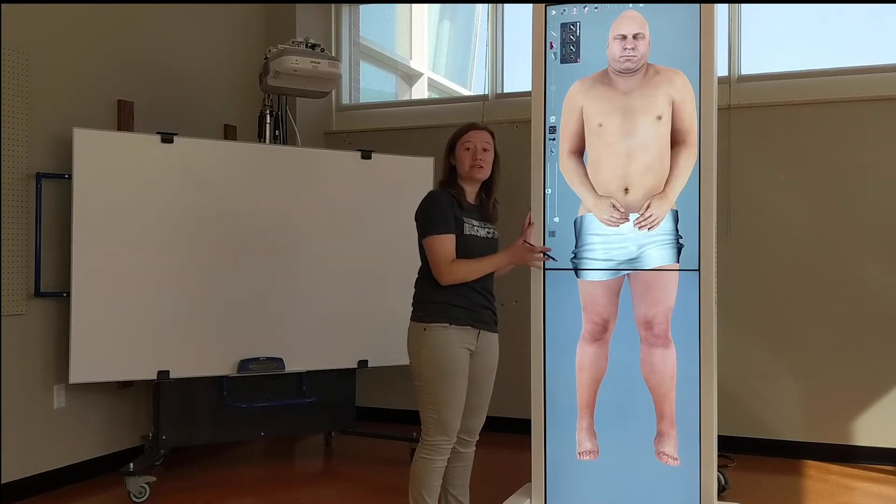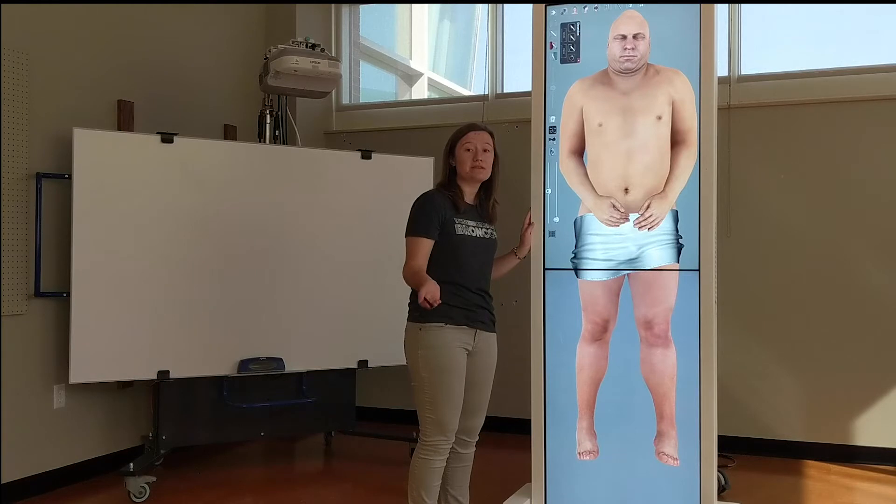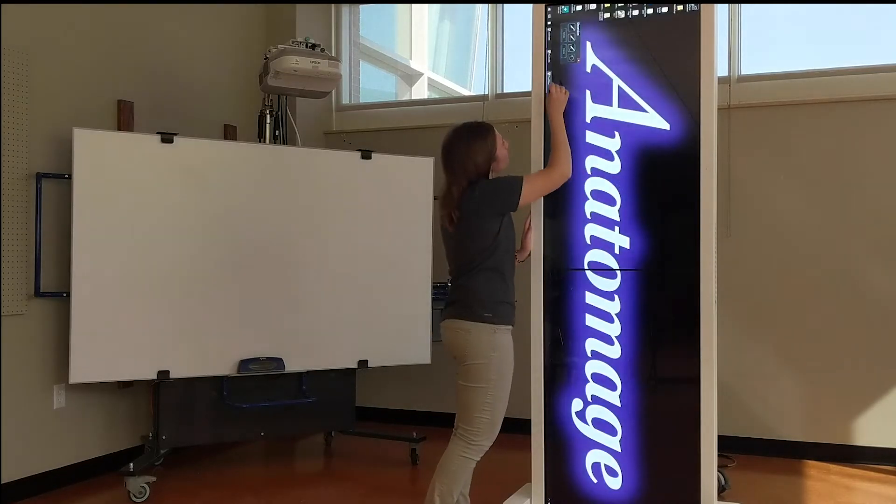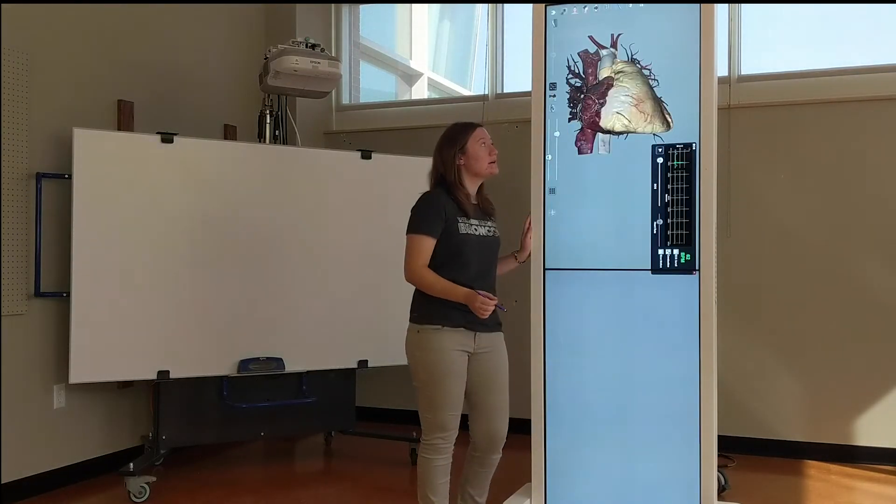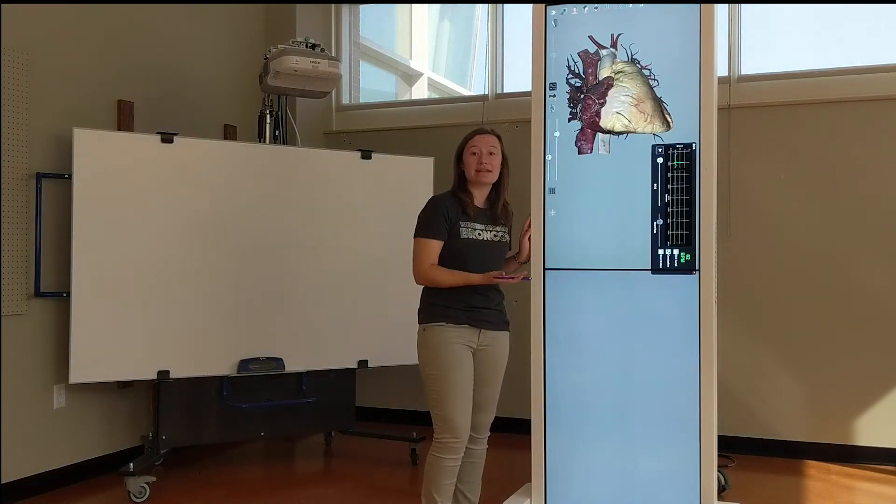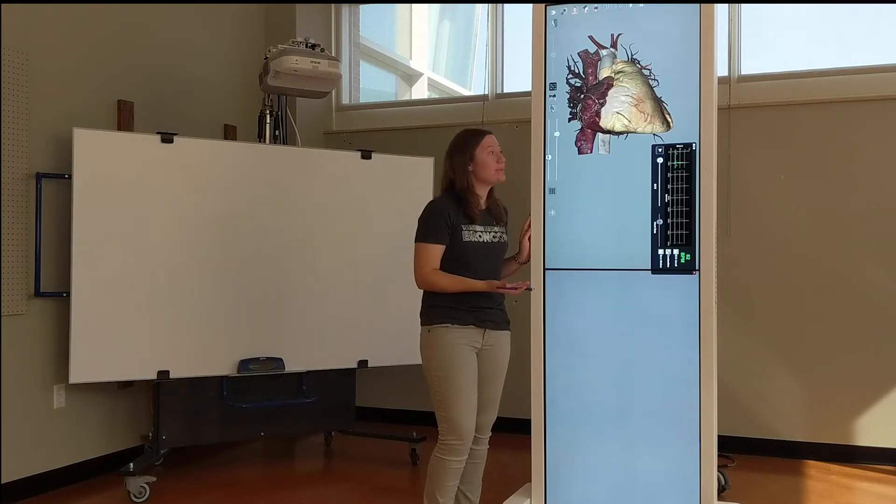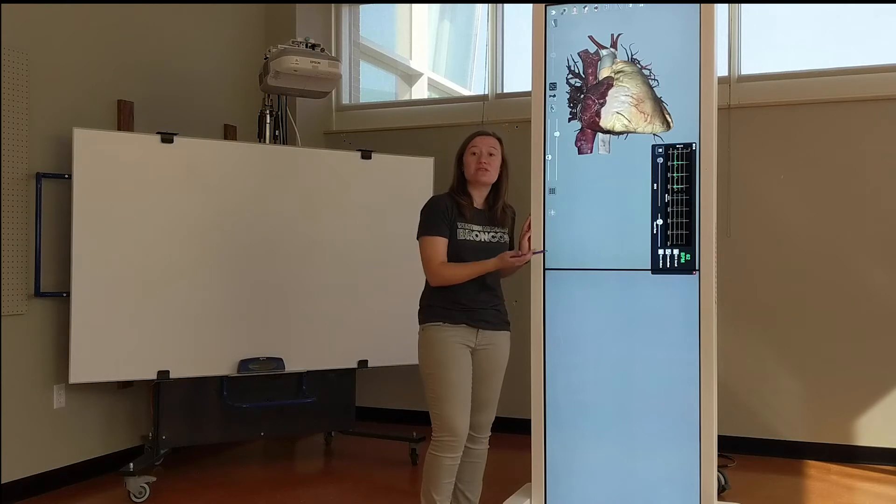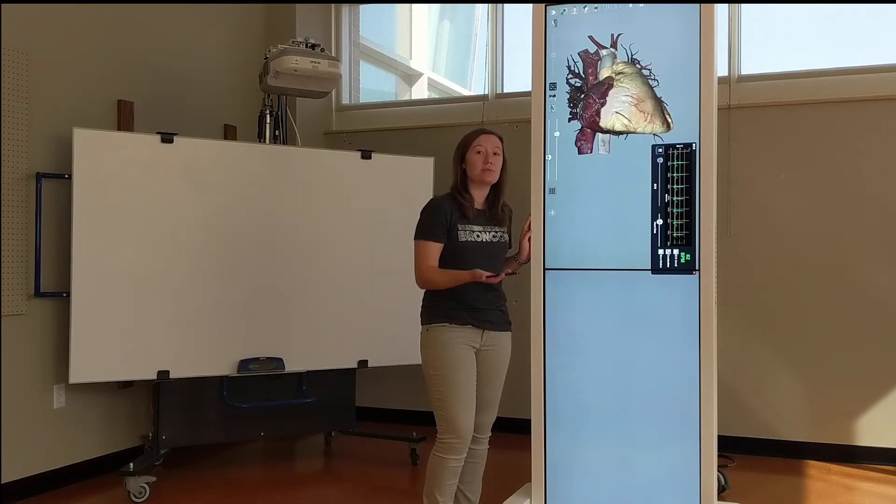Along with dissection on the full cadaver, there are also different parts of this table that can be dissected such as the heart. This is also a heart that has been scanned onto this table. It shows how it beats. This is part of the physiology section of the table and it's very useful to see actual motion.